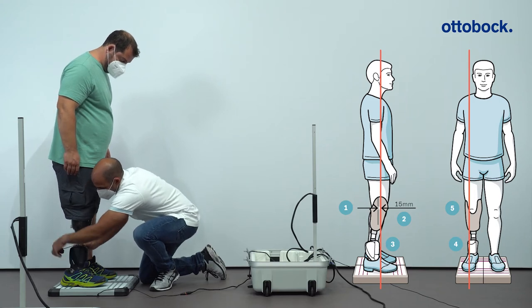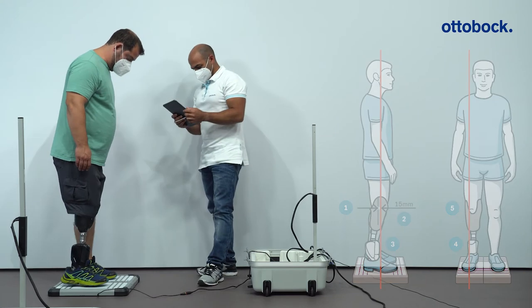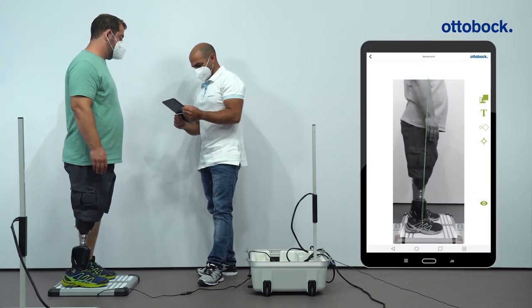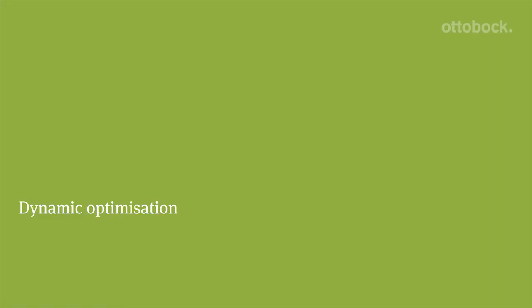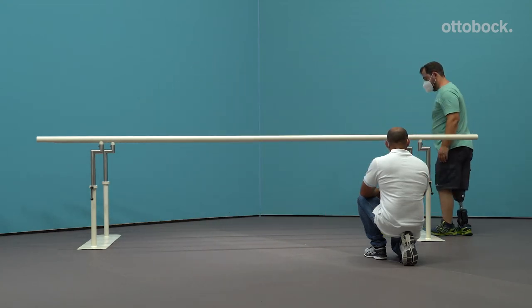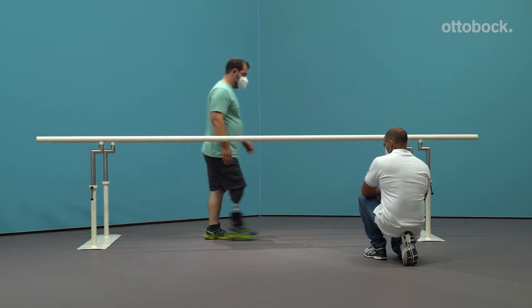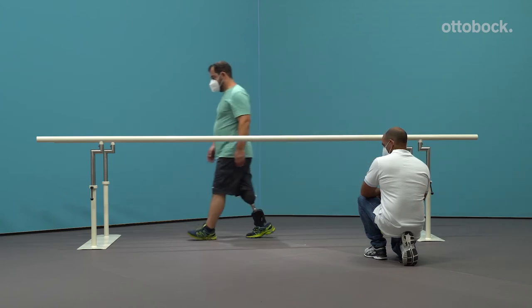The load line should run along the lateral edge of the patella. The goal of the dynamic optimization is a physiological knee movement. The first goal is to avoid a completely extended knee joint during heel strike. The alignment should encourage a slight knee flexion moment during initial stance phase. A more physiological knee movement can be achieved if the AP position of the prosthetic foot is optimized.